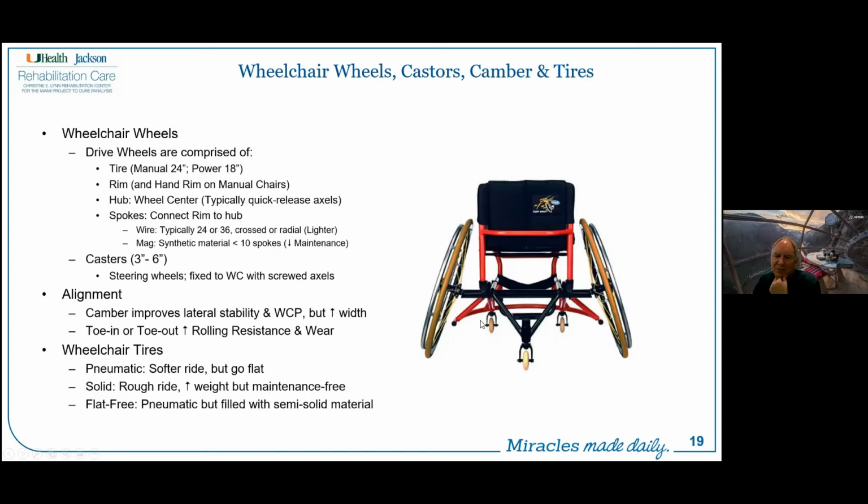The thing is with the sidewalk cracks, a lot of times these smaller casters will get stuck. So you have to consider that, depending upon the environment, you might want to go to a 4-inch or a 5-inch caster, so that you don't have quite the mobility, but you don't have to worry about getting stuck as well.